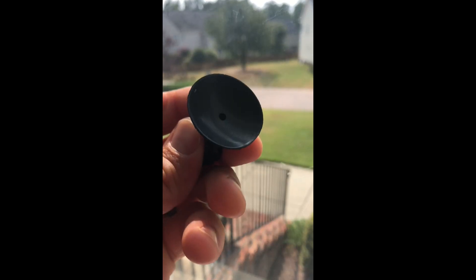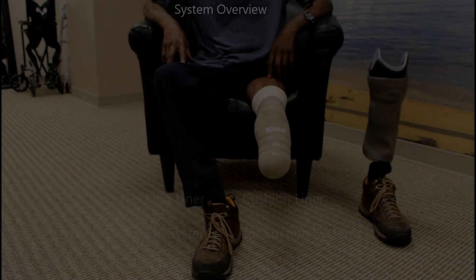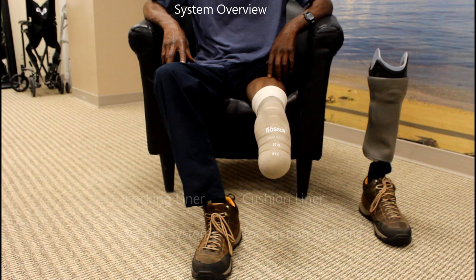A suction suspension prosthesis utilizes the same laws of physics and thereby can effectively hold your limb inside your socket. Basic knowledge of the elements within a suction suspension transtibial prosthesis will be helpful.